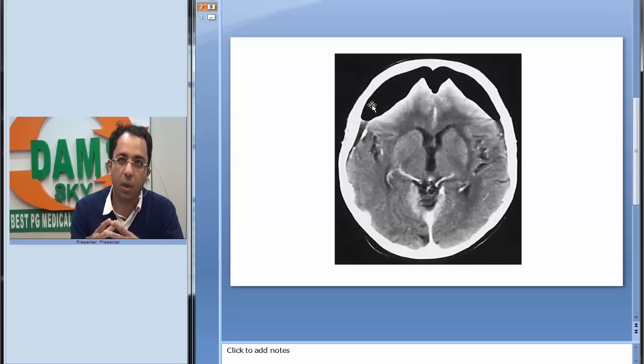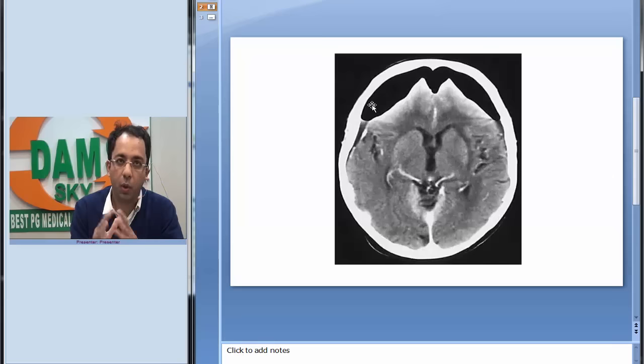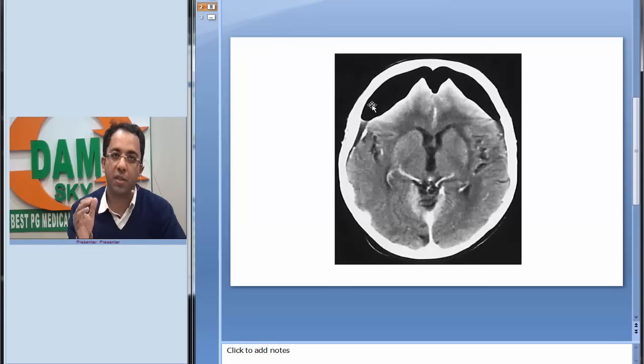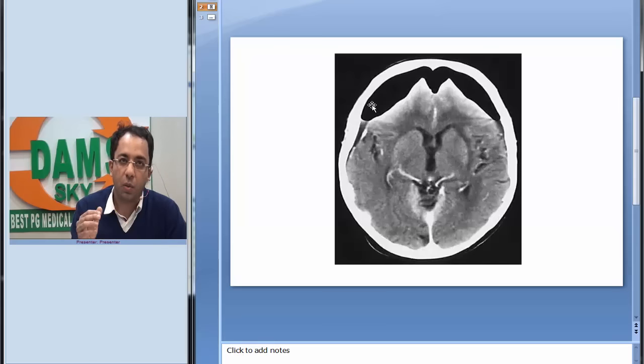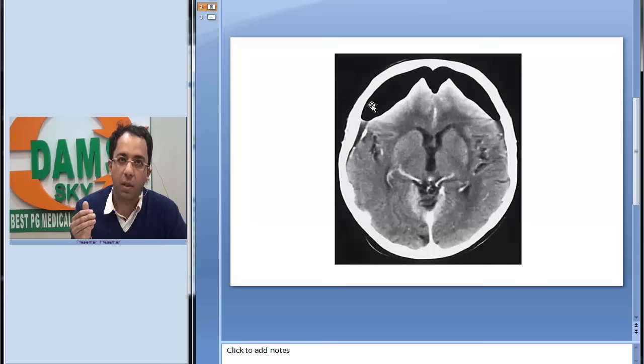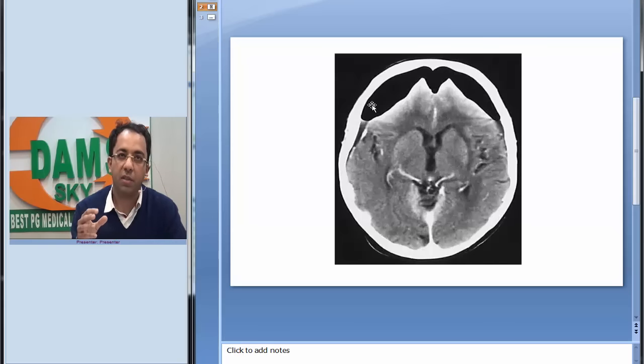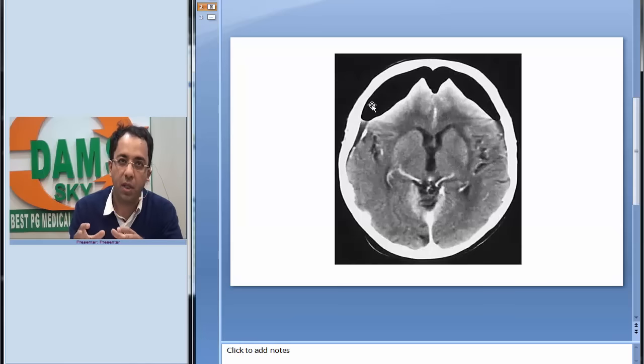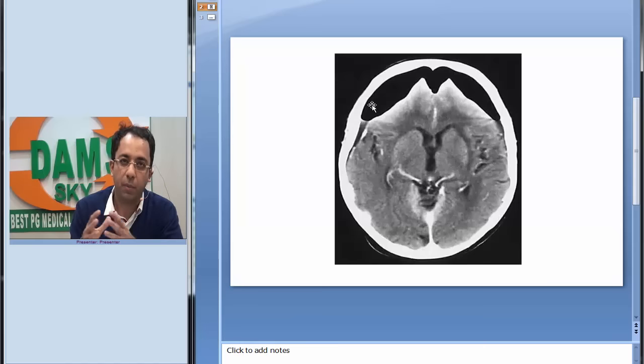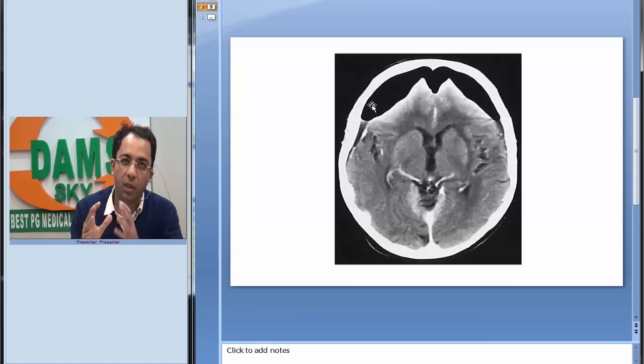What do you think is the diagnosis? Pneumocephalus. So what is so interesting about pneumocephalus in this patient? Pneumocephalus is a very common post-operative finding, and you may also see pneumocephalus after head injury, but usually this air is resolved.